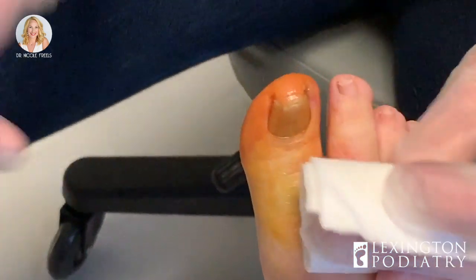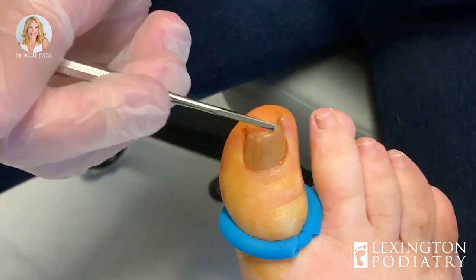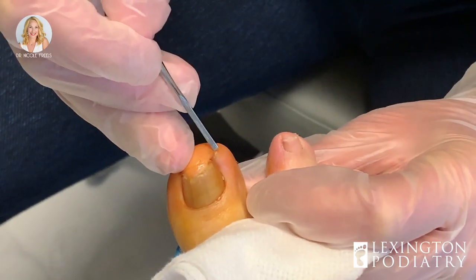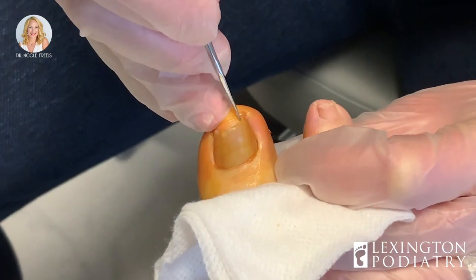Alright everybody, let's get started. This is a deep ingrown toenail with a fungal nail as well — it's thicker than normal, with an abscess at the tip. This is a very common place to see an abscess.